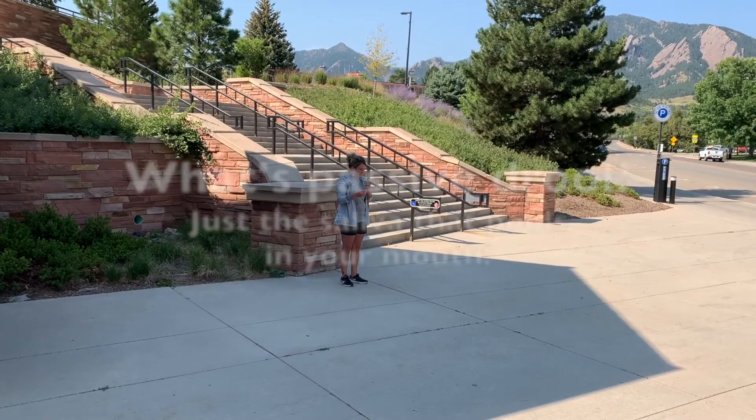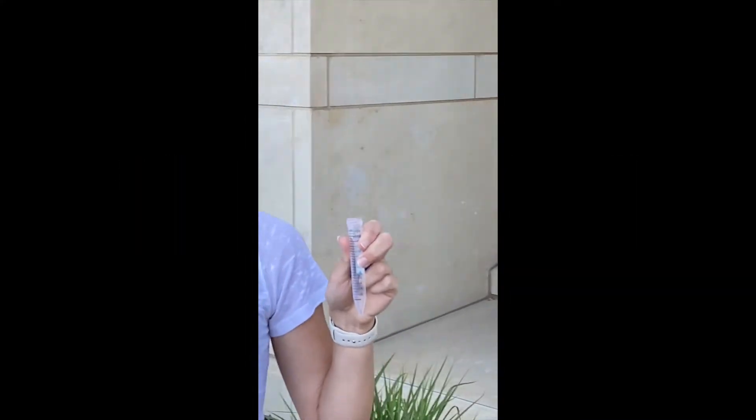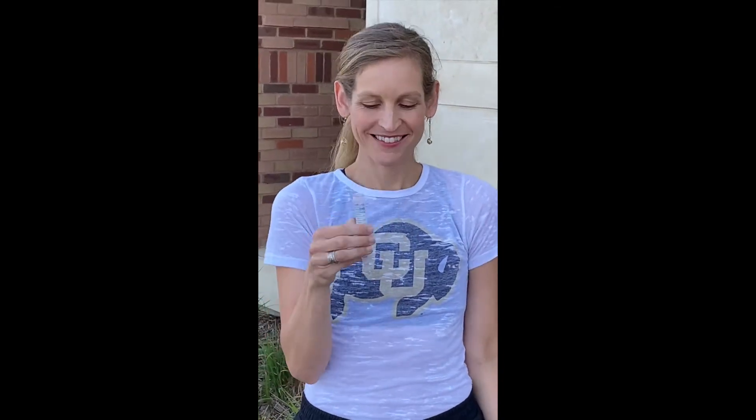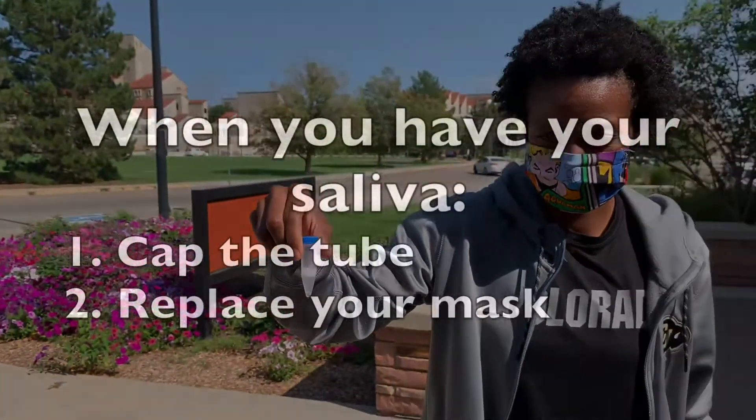Now we drool for school. It's important that you just collect passive drool, which is the saliva that pools in your mouth, nothing from deeper in your chest. You want to collect one milliliter, which is marked with a black line on your tube. Bubbles are okay, but the liquid needs to come up to the mark. No more and no less, please.